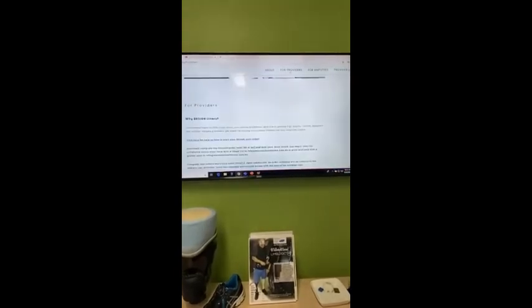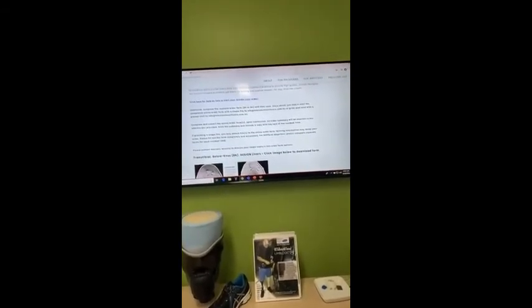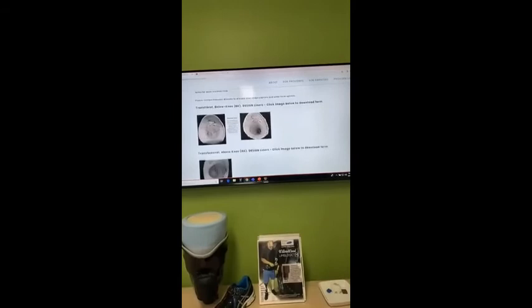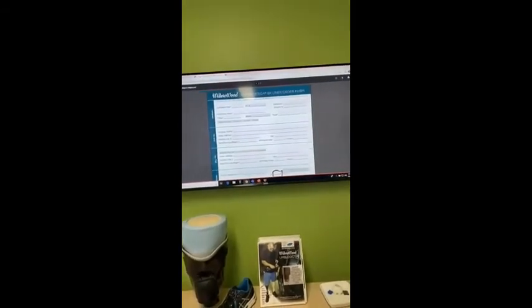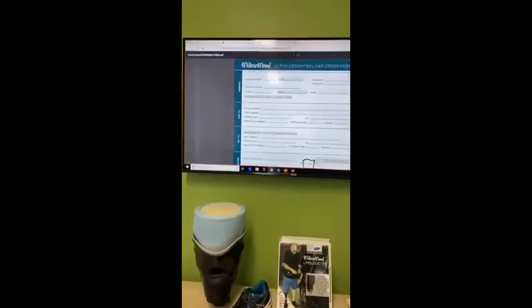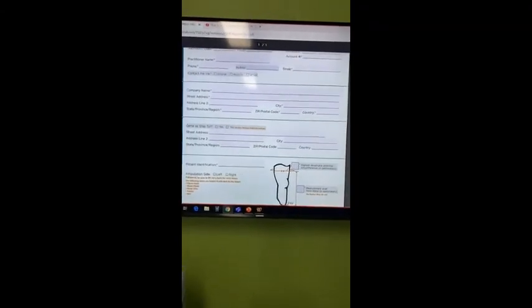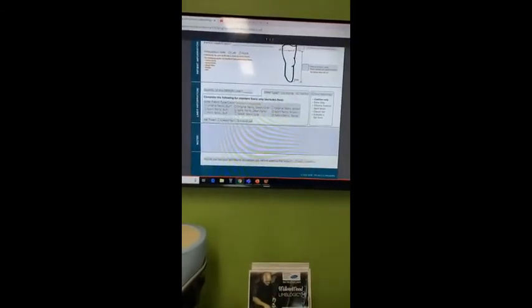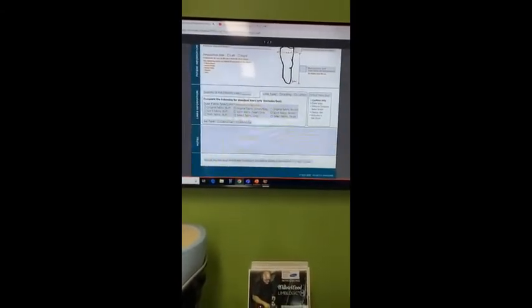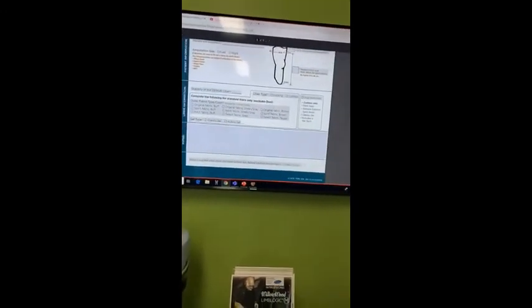So with providers, we've got different links to different forms. So with our transtibial forms, if you click on the view, it brings up our BK design liner order form, which you can fill in all the information. Anything that's got a red asterisk, we like that information there. It asks you the quantity of the liners, whether you're locking or cushion or duo, the fabric, the gel type, everything that we ask in the software.